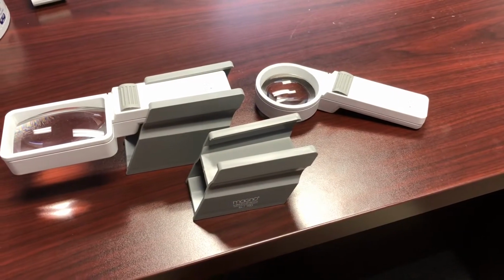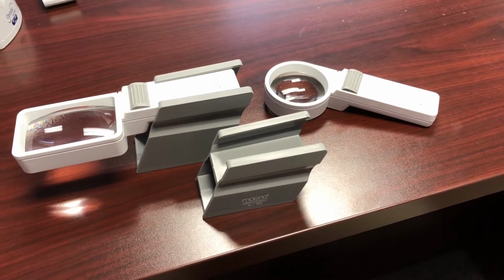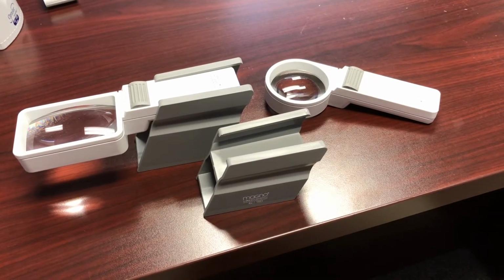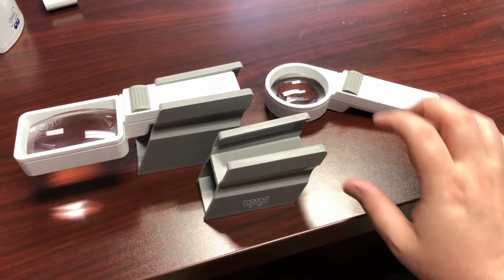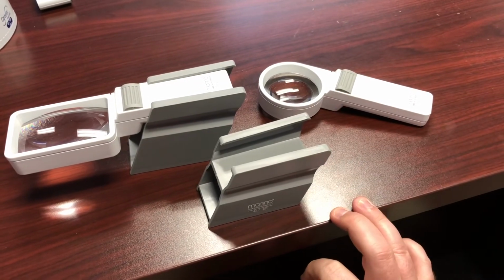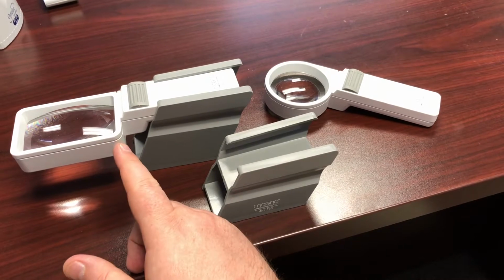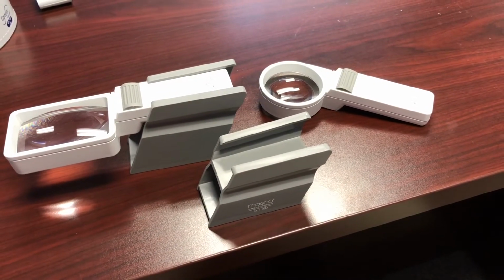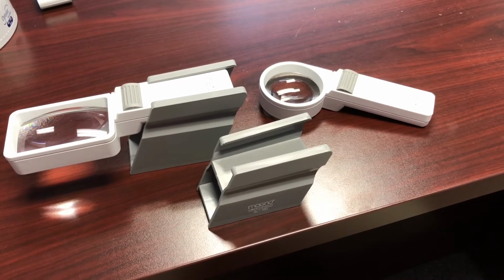Magno, which is made by Eschenbach, is a competitor of the Powermag. Here we have two hand magnifiers that have an adaptable slide stand addition that can turn the handheld into a stand magnifier. On the left is a 3.5x, on the right is a 4x.